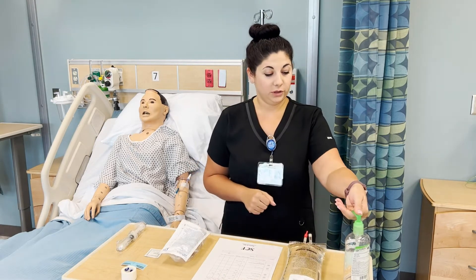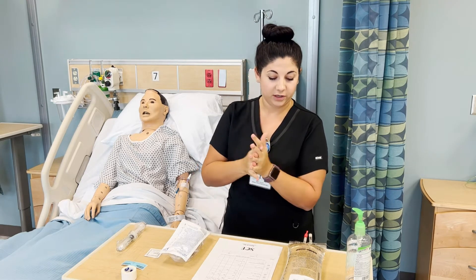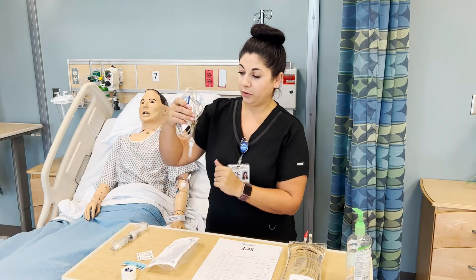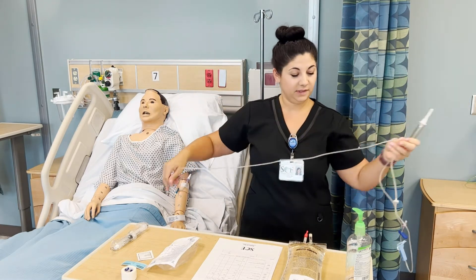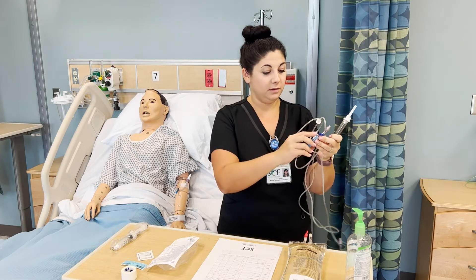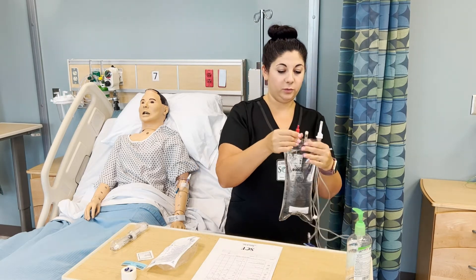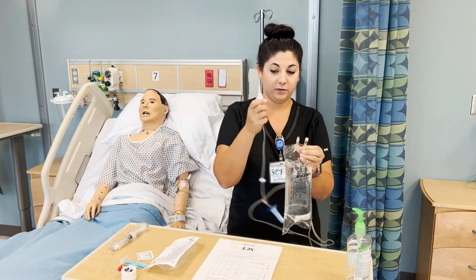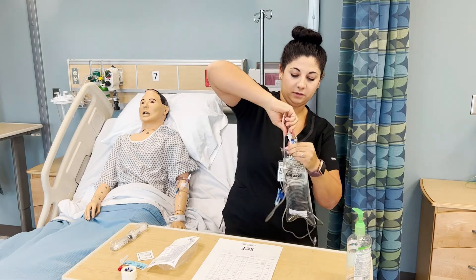We are going to wash our hands and get this bag ready to spike. I have already checked my expiration date and ensured that my fluids are clear. I'll pull out my tubing and try to straighten it out. We're going to move this roller clamp as far up as you can and clamp it. Inverting your bag, take off this cap and remove this cap, ensuring that you maintain sterility of both the spike and the bag. Going straight in, twist back and forth until that is all the way in the bag.